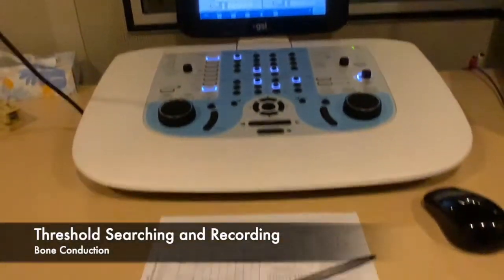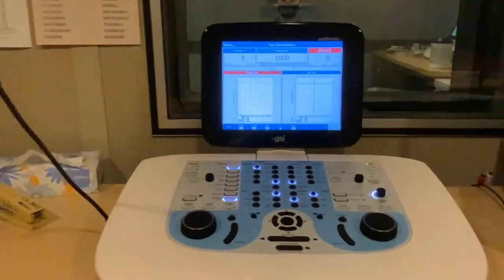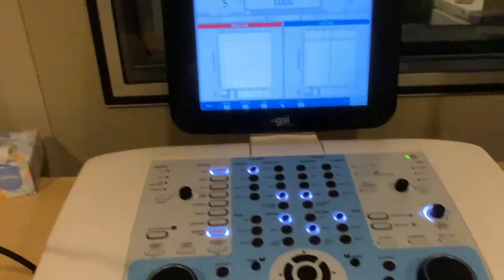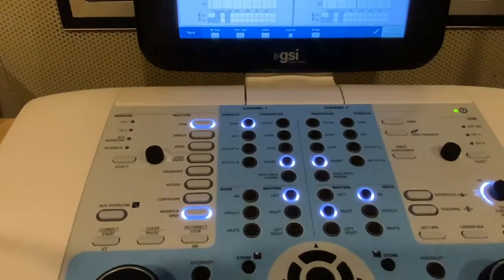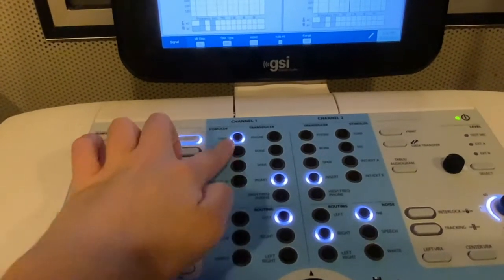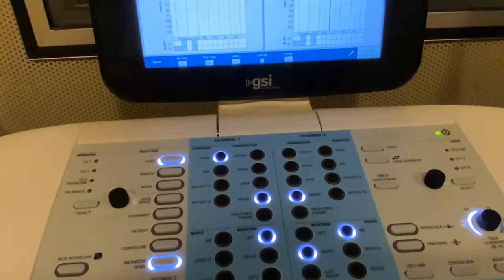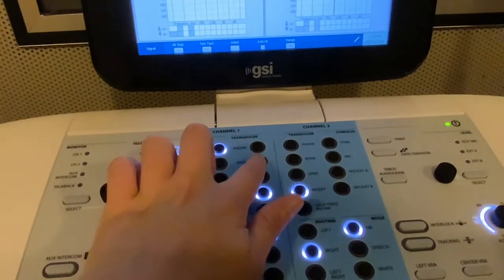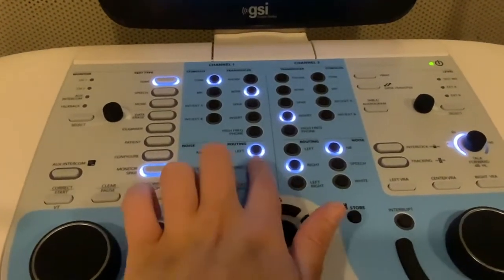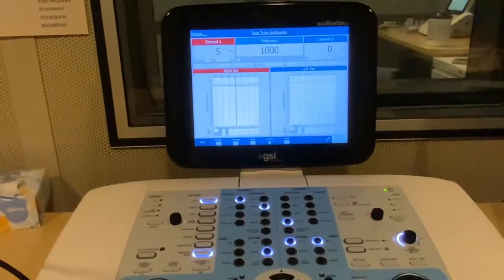Okay, we're back on the other side of the booth, and it's time to record some bone conduction thresholds after we finished all that air conduction. So once you have the oscillator placed and you are all set, you're going to make sure all of the settings on the audiometer are correct. So we're still using tone here as well. And then we're going to transition to bone. And we place the oscillator on the right side, so we'll select right for these purposes.